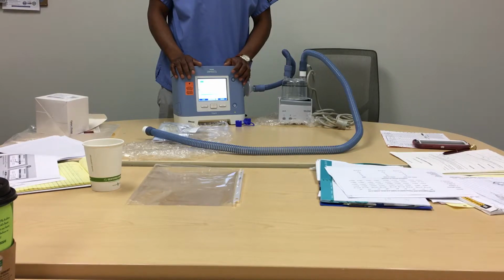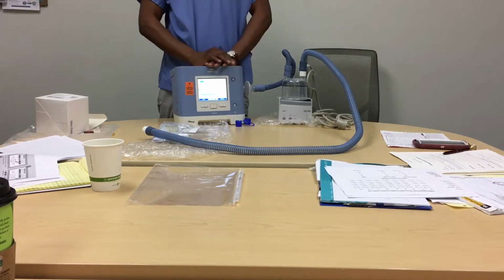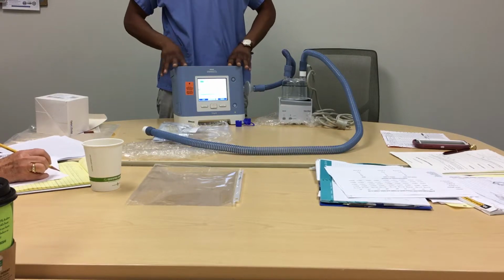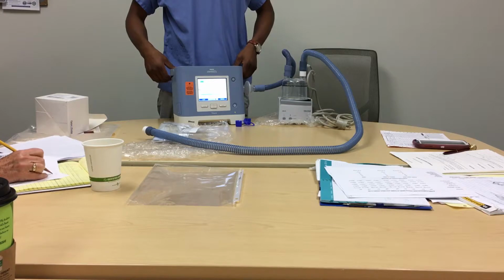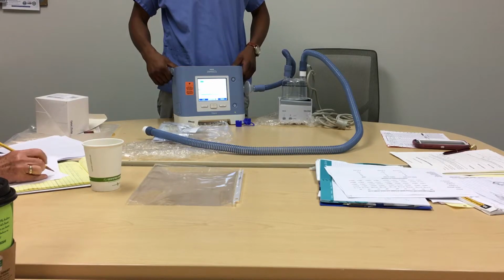Okay, so that was another question. In talking with my pulmonologist, I'm trying to figure out where we go, because they're on BiPAP, ASV versus AVAPS. What is ASV? Typically, with AVAPS, you use it when they have failed on the ASV.